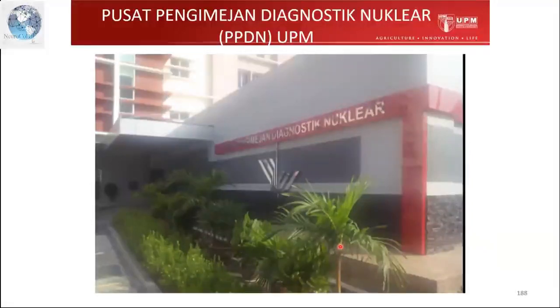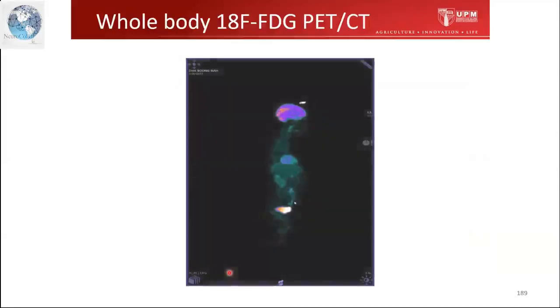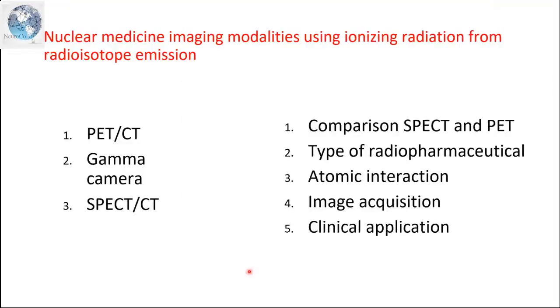And this is our nuclear imaging center. It's a research-based center in the Faculty of Medicine, just next door. In the Faculty of Medicine and Health Sciences, we have a separate imaging building. There's a PET-CT scanner and MRI and ultrasound there. So in this PET-CT scanner center, we can do whole body imaging, which can look at glucose metabolism in the body.